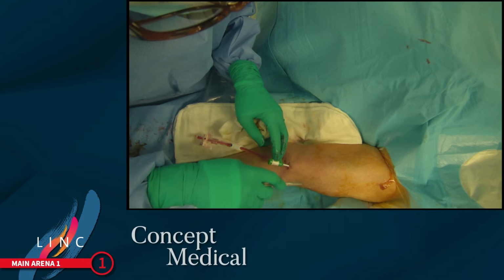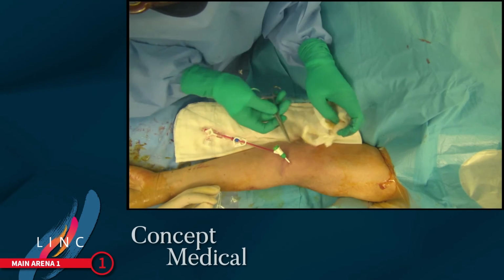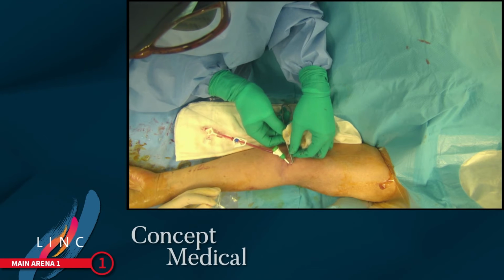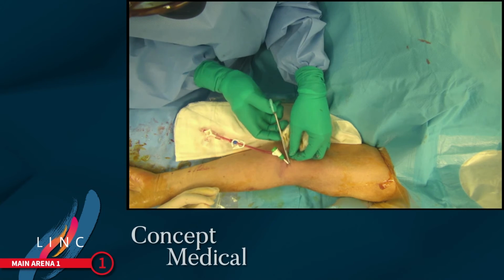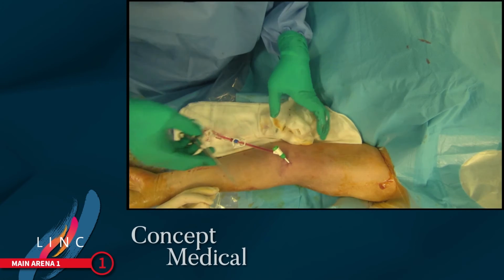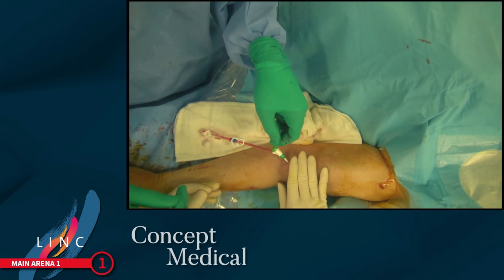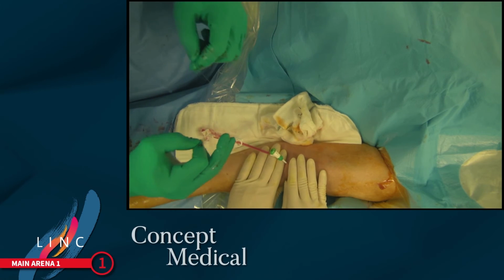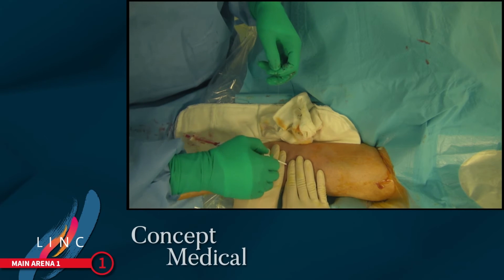obviously important. The last part just shows you the way that we like to handle the puncture site. There are many ways. I like to do a purse string around it. You can see over here with an absorbable monocryl suture, in this case so that the dialysis center nurse doesn't have to remove the suture and the patient does not have to come back after this intervention. So usually the patient leaves within the hour after the intervention and gets discharged home.